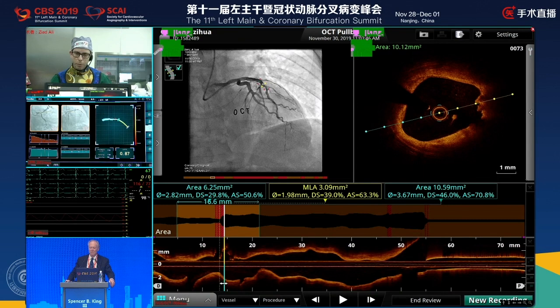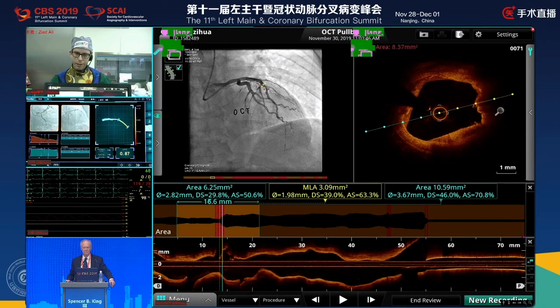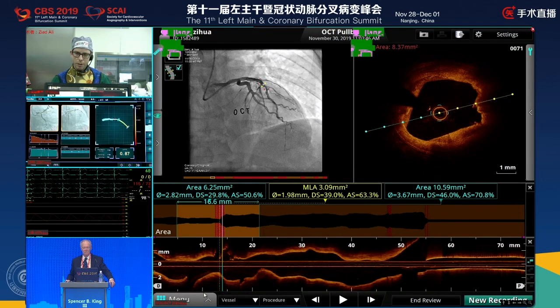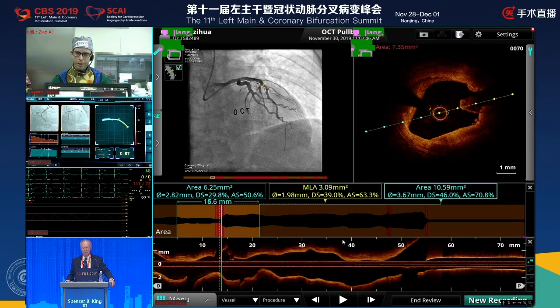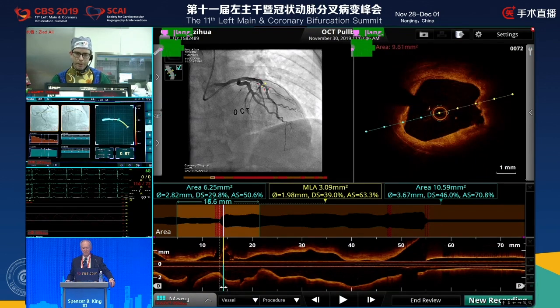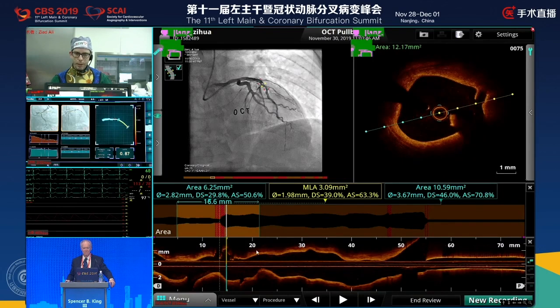And when we go a bit further distal, we can see here we have the septal branch at 3 o'clock. Go a bit proximal again, and we can actually see we have this protrusion of another calcified nodule just here, very proximal to that. Again, it must be expected to be very hard, and could be something that is organized within a short time, but it could also be of older date. But at least this one looks a bit more acute, with a small plaque rupture just here to the right of it.